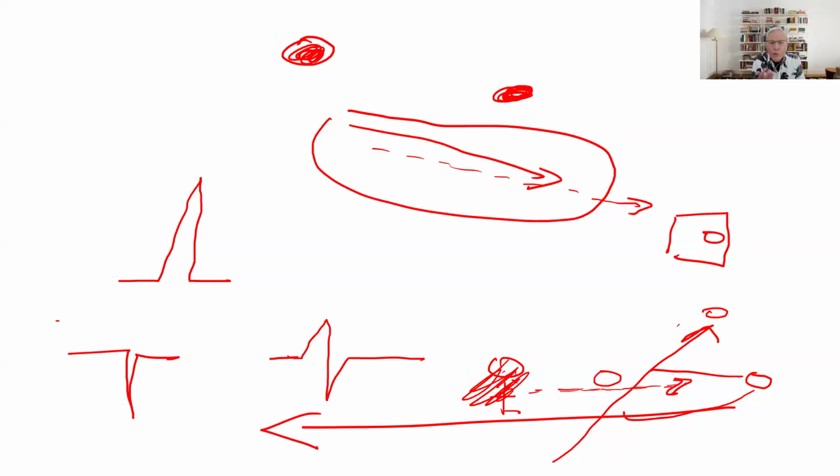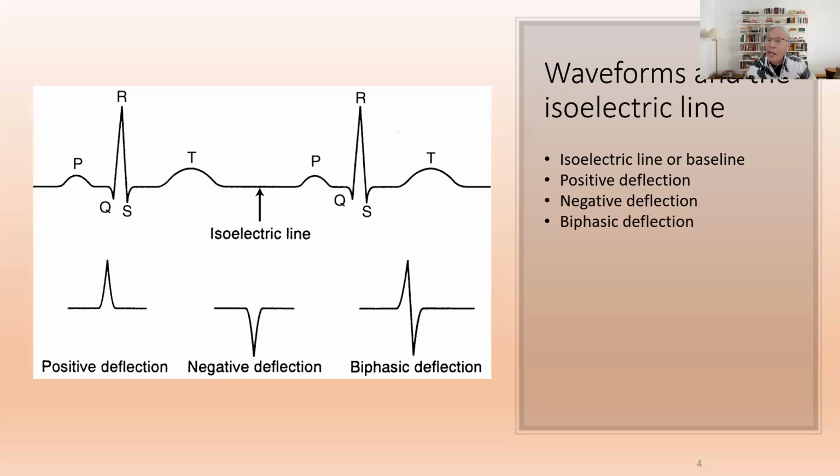Dr. Tom, why is it that when I see ECGs, sometimes they're going up and then sometimes they're going down? Well, it depends on the position of the camera. And the camera in an electrocardiogram is what is known as the lead. Okay? So usually we get a 12-lead ECG. That means to say that we're going to have 12 cameras that are going to be positioned around the heart, and therefore it depends on the position of that specific camera.